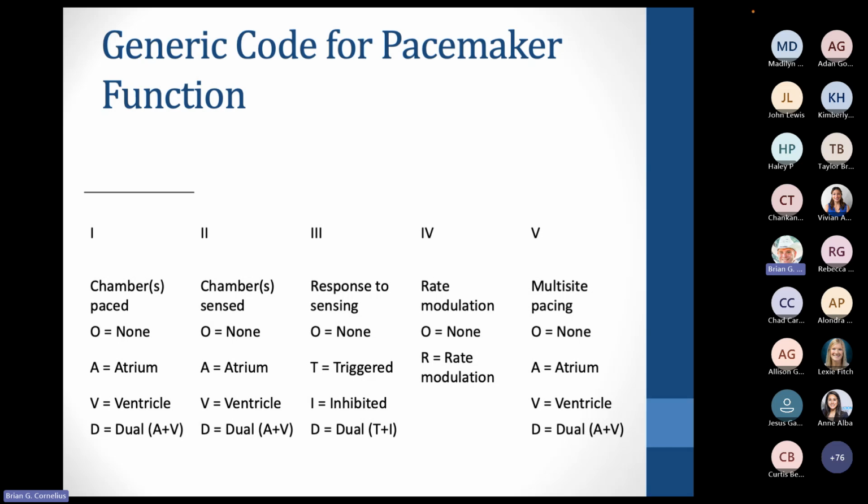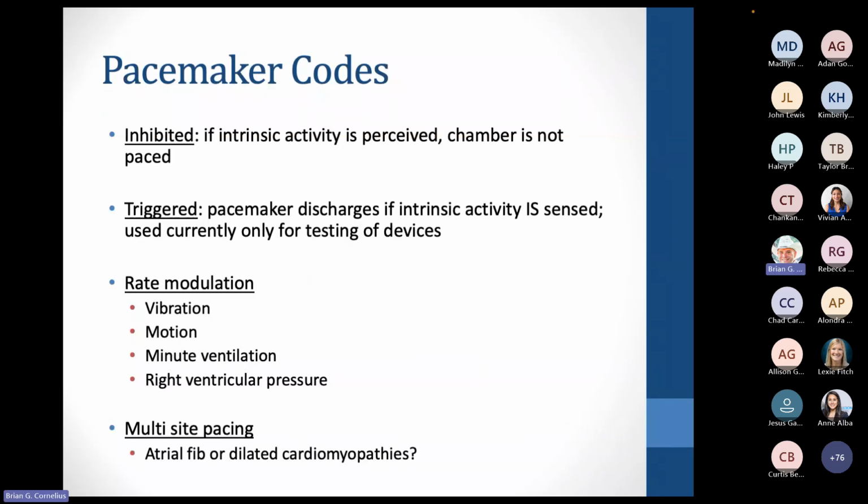So make sure you know that chart. You'll see that again on boards for sure. This is just what I was talking about as far as the activity. So inhibition, it's not going to pace. Triggered, it will discharge. And they really just use that for testing of devices for the most part. So it may be to demonstrate that it's able to pace.